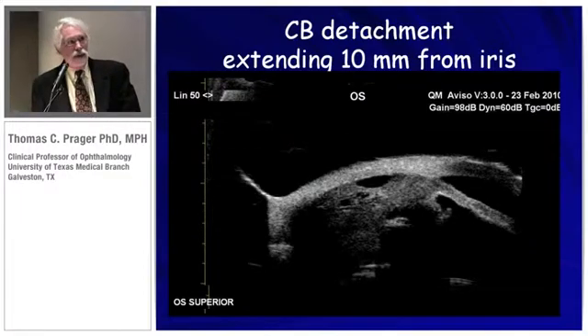Here's an example of a large ciliary body detachment, and you can see it on the side of the eye. In the traditional use of an eye cup full of goniosol and saline, this would be impossible to do without causing a massive abrasion.